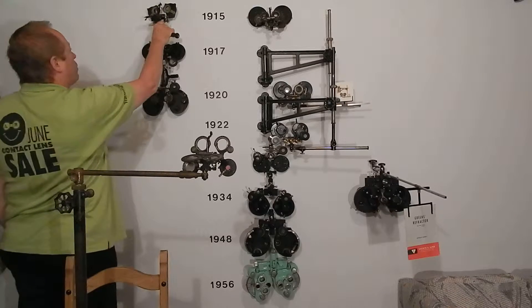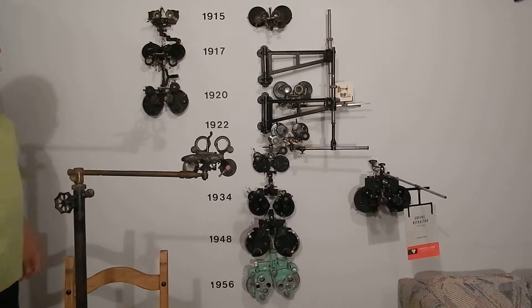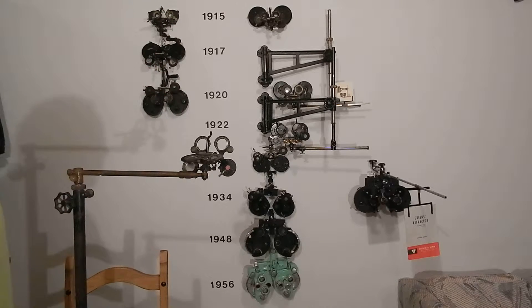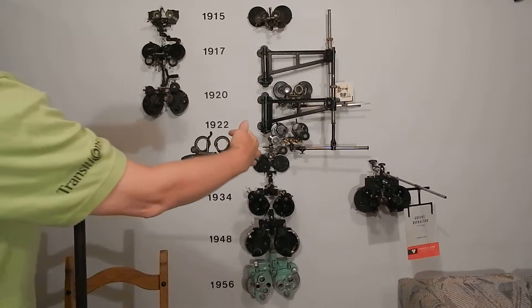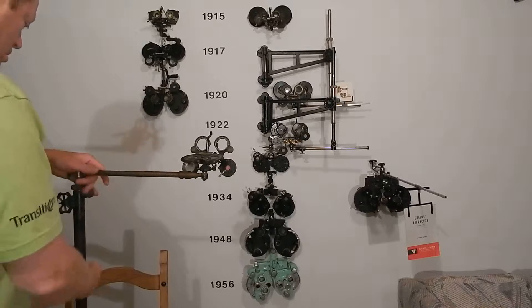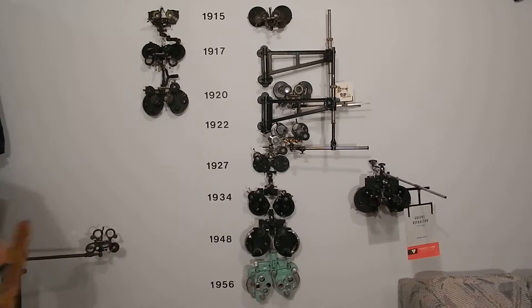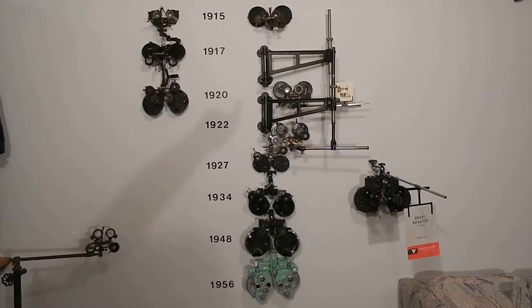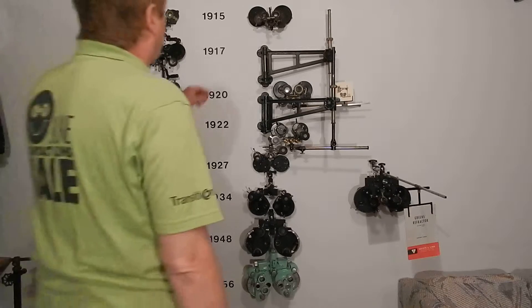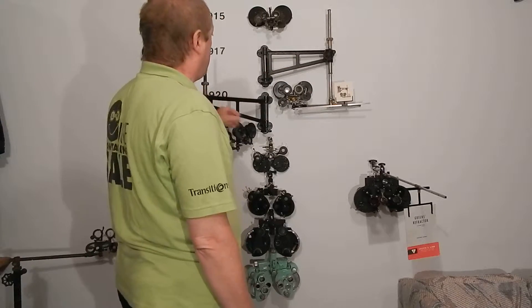They're both trial frames, so no matter what the range is you can put more trial lenses in, and there's even a mechanism for rotating the cylinder — the same thing. They sold very, very well — de Zeng made a mint. These have one-inch lenses, the biggest lenses ever on any phoropter. He must have figured that was too big, because in the 1920 model of the same thing he shrank them down to three-quarters of an inch.